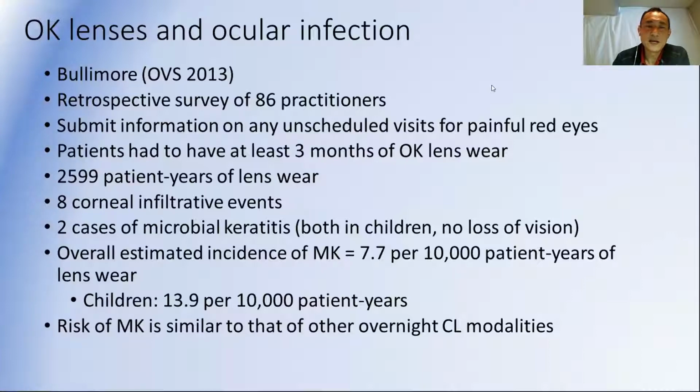So in my patients that have low refractive errors like that, where the patient's concerned about myopia control and wants to get them into lenses early, I tend to recommend soft bifocal lenses, because I know I can create more myopia control effect even in those low myopes. If parents want to continue with Ortho-K despite that recommendation, I will still fit them, but they have to understand that there's less myopia control effect, so they may still progress more so than patients who are higher myopes.